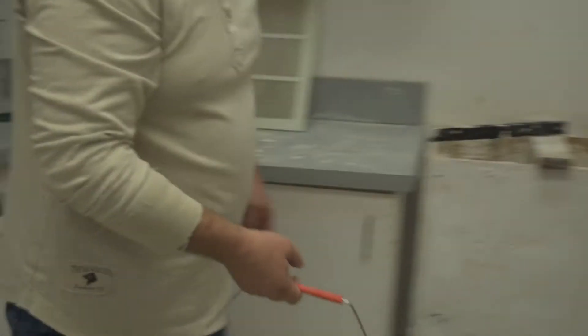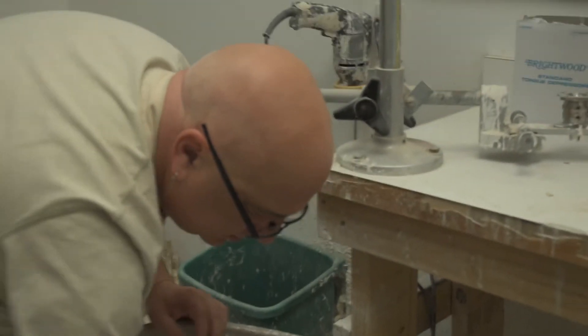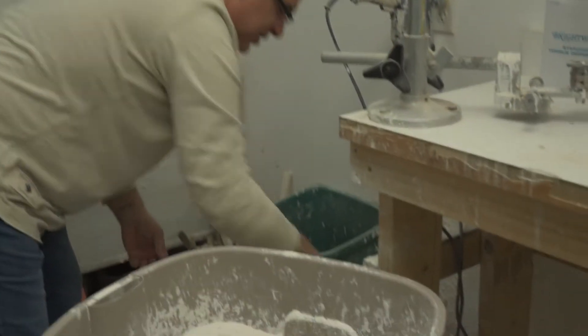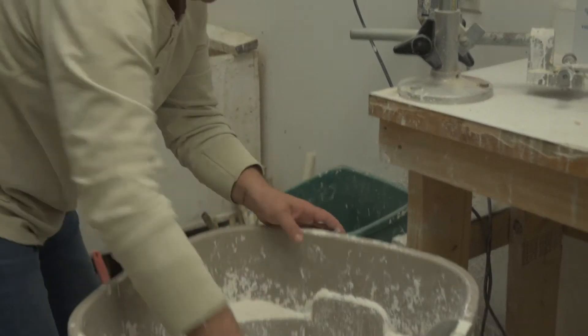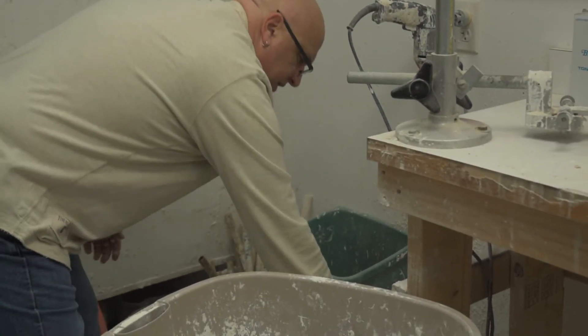After I take the cast, I fill it with plaster. This is to mix the plaster — we just buy it in bulk and go through about 500 pounds every two weeks.